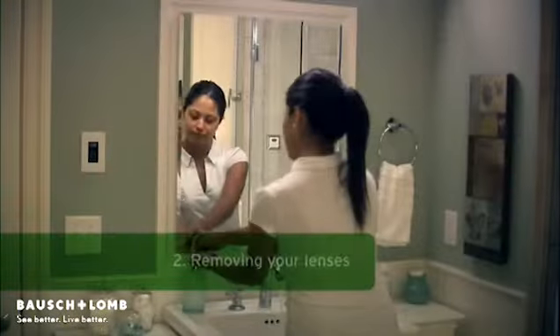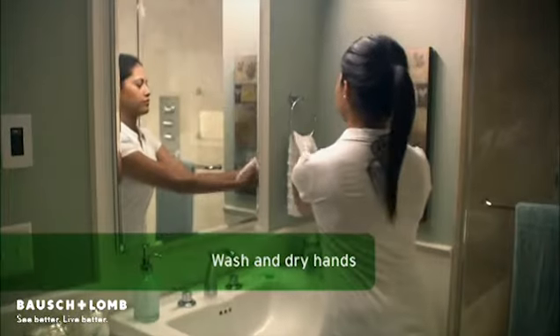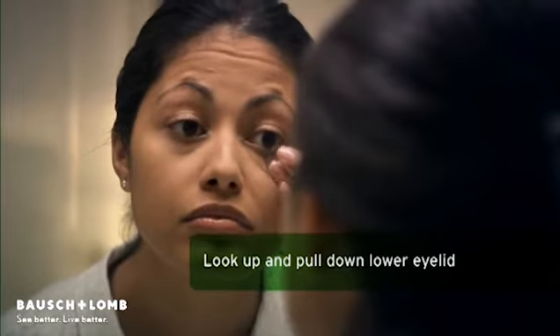Now that we've covered applying your new lenses, let's talk about removing them. Like before, wash your hands with soap and dry them with a lint-free towel. Remember to close the sink drain too. Look up and pull your lower eyelid down with the middle finger of the hand you write with.